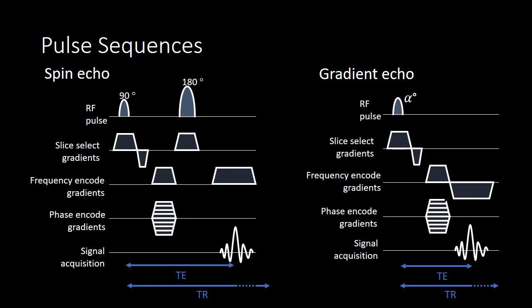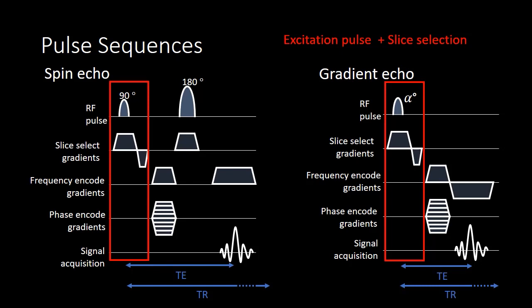And what most of us use in our day-to-day lives is actually pulse sequences. So we use all of these concepts, but we use them in the form of pulse sequences. And so I wanted to use a spin echo and a gradient echo pulse sequence to just summarize some of the concepts. So we've started with an excitation pulse, which tips the magnetization into the transverse plane that we've talked about over and over today.